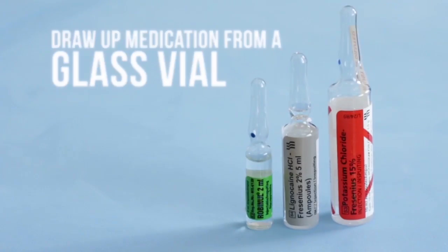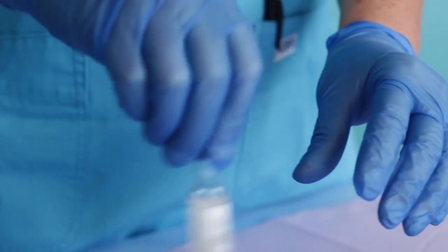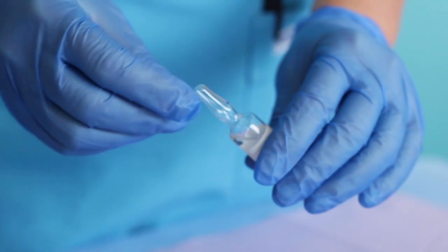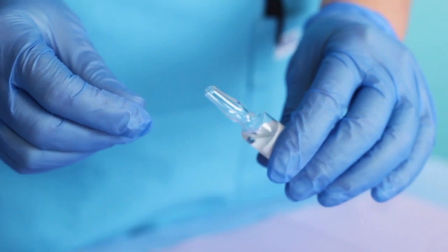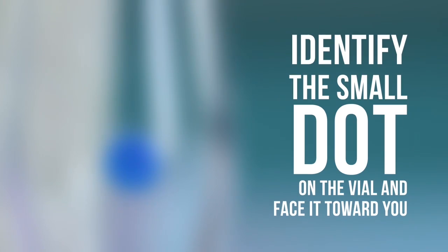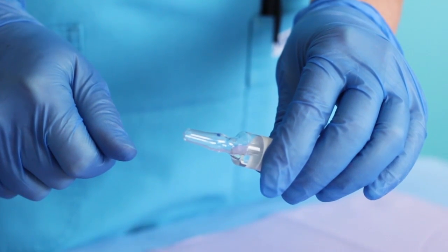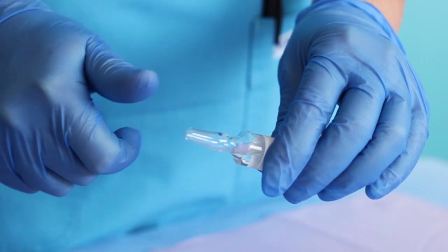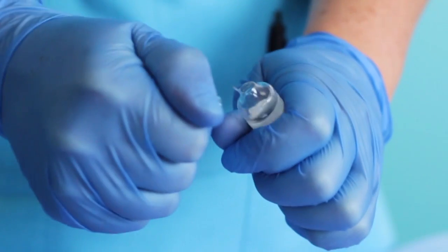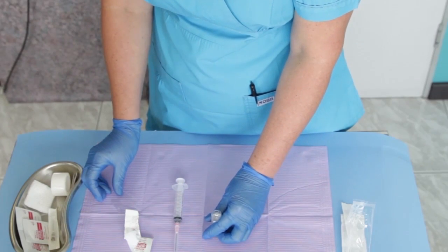If you need to draw up medication from a glass vial, follow these steps. Hold the vial upright between your fingers and swivel the vial two to three times in a circular motion to ensure that all medication is in the bottom of the vial and not in the top. Do not flick your finger against the vial as you may break the vial and injure your finger. Identify the small dot on the vial and face it toward you. Hold the main body of the vial between the thumb and index finger of one hand and the top part of the vial between the thumb and index finger of the other hand. Crack the vial open by bending the top back in a single definite action, then place it upright on the work surface.